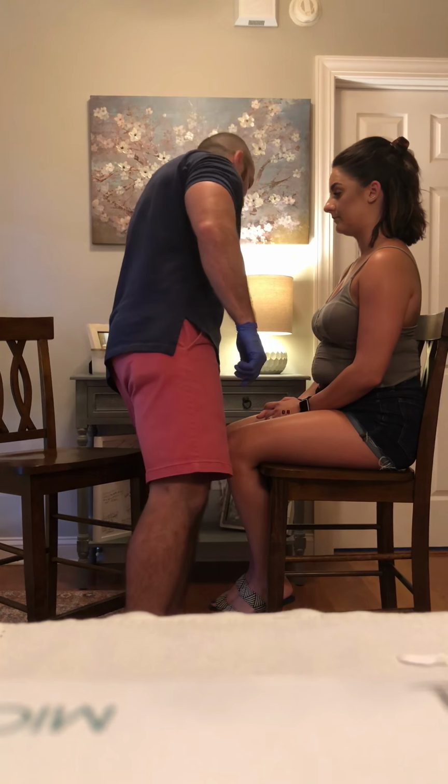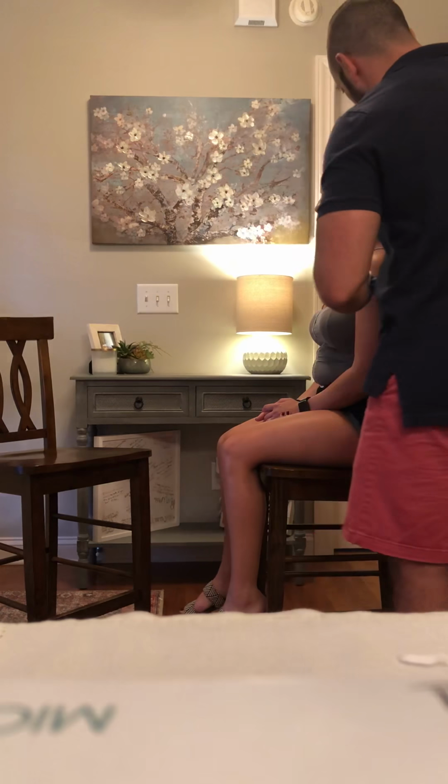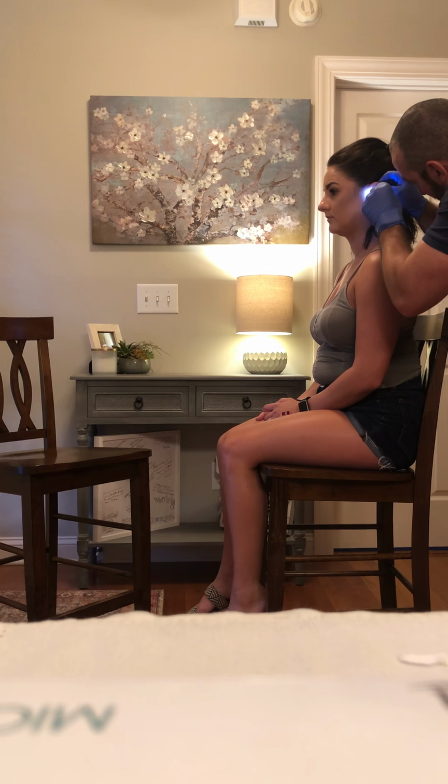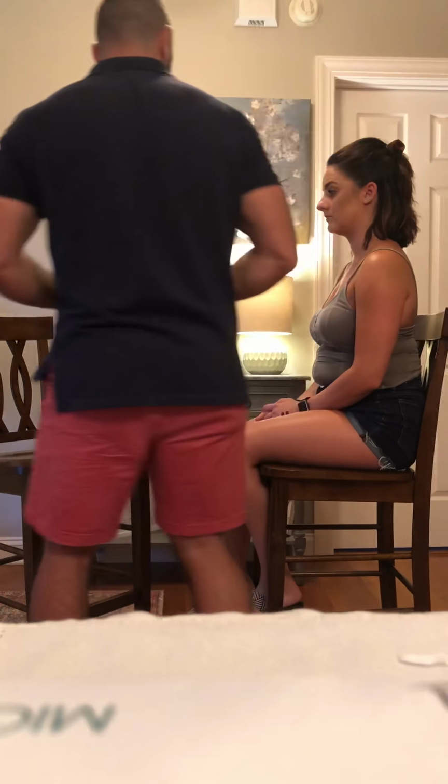All right. Then with her ear, I'm just going to look at her external auditory meatus here. I'm going to pull the pinna up and back. Look in there. I'm just looking for any drainage or anything like that. All right, don't see anything there.